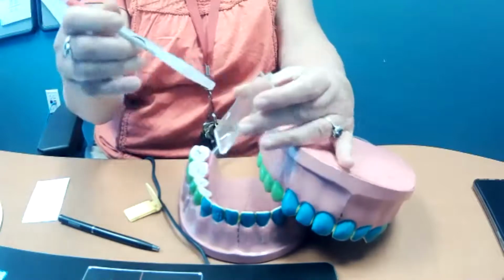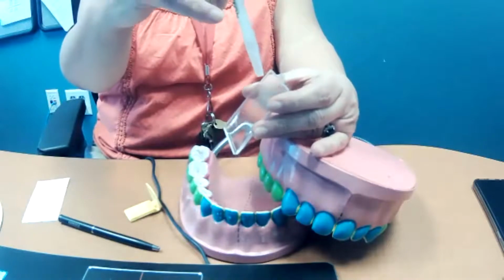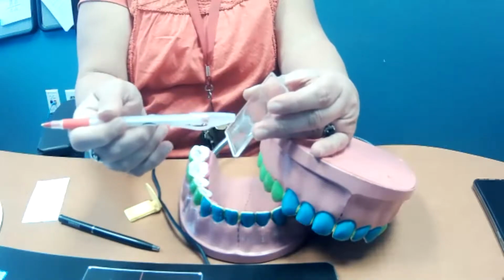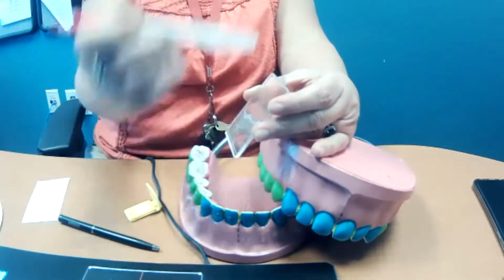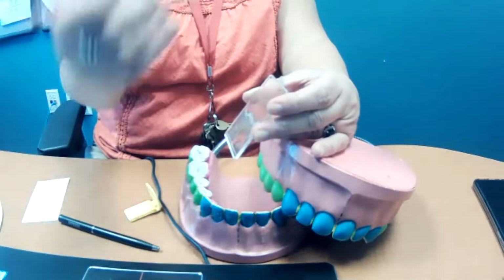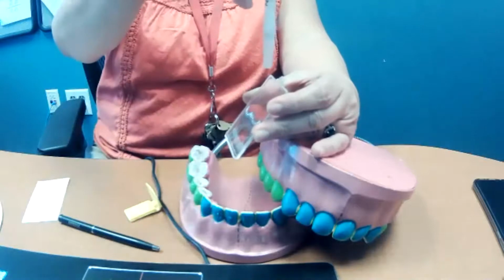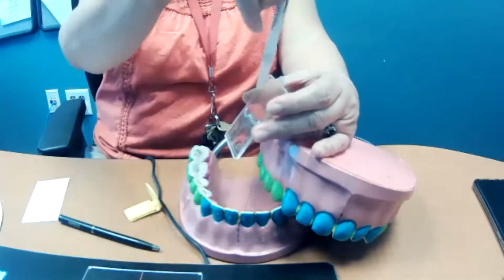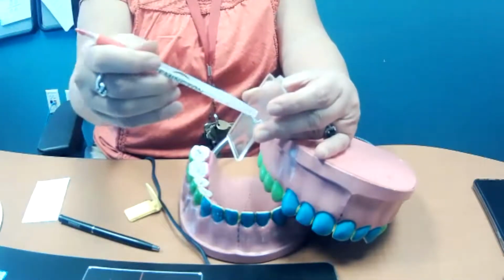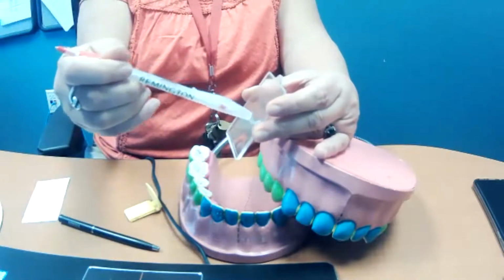So it's the same way with your teeth. I always say too little, right? Too little angulation. Wait a minute, too little, that's this way, sorry. Too little makes my tooth look too long. So too little, too long. Too much is too short. Students get this mixed up all the time. So basically, too little, too long, too much, too short, okay? But it's all about this. Everything needs to be straight on, or perpendicular to my film.